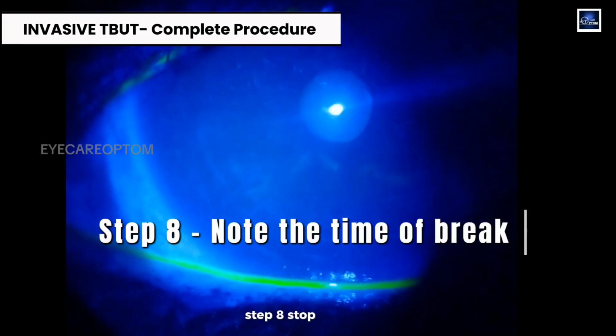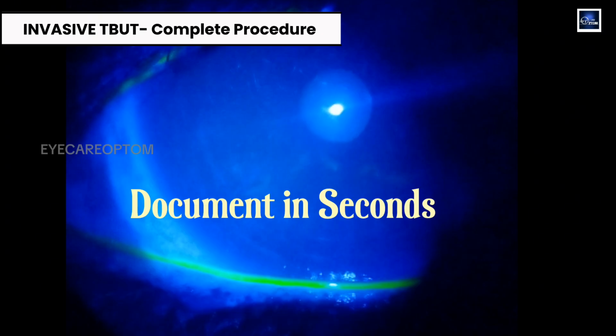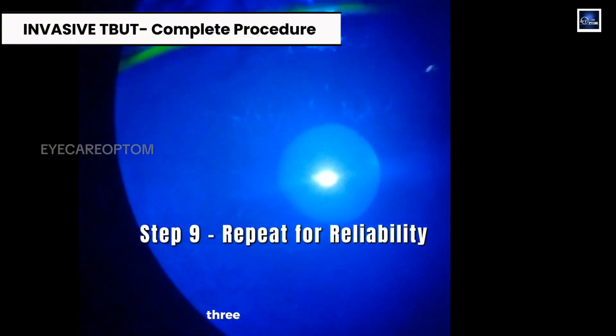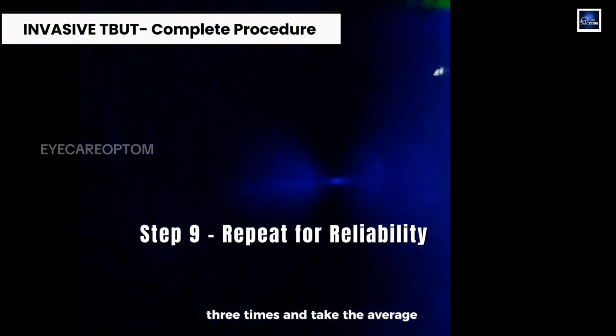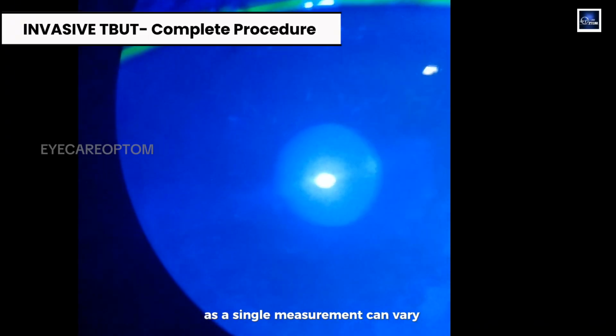Step 8. Stop the timer the moment you see the first dry spot appear. Record this time in seconds. This is your TBUT value. Step 9. Repeat the measurement 3 times and take the average. This gives a more reliable result as a single measurement can vary.